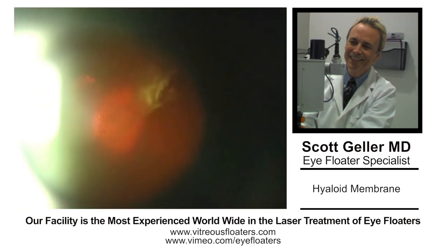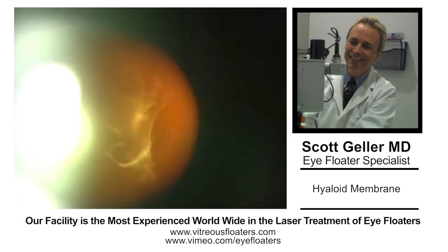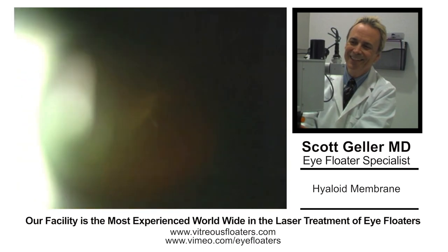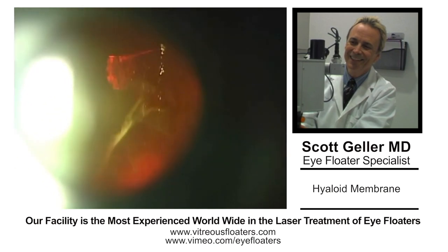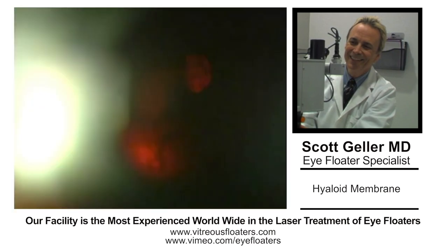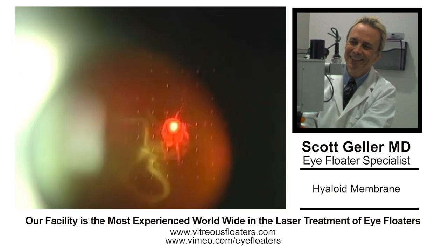We're continuing to cut the vitreous membrane here. It does take quite a bit of time to do this. The goal is to create a nice window and ultimately clean up all the debris. There will be a lot of debris from a case like this, and this is the main reason you have to go back and do at least 4 laser sessions. There's a limit to the amount of energy you want to put in for safety purposes — there are complications from too much energy in one session. That's something we teach our students who come to us to learn the technique.